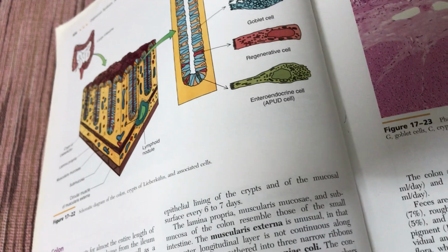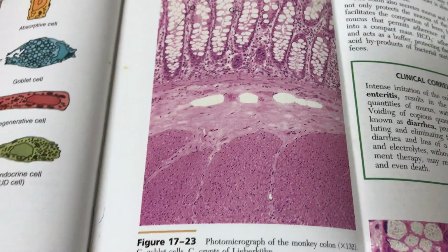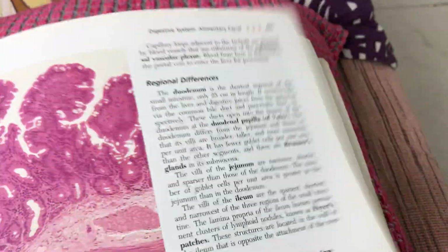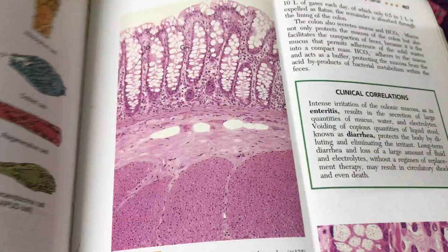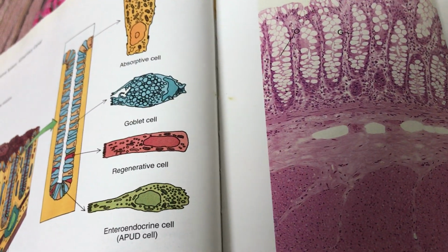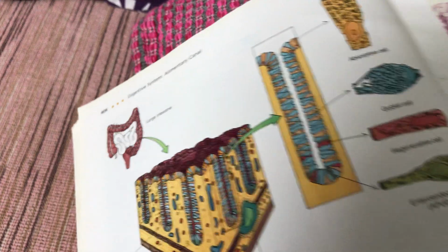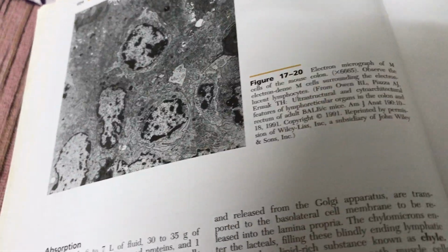Ileum, the important feature of the ileum. Here we will see the colon. Where is the intestine? See, ileum, what is the important feature? Everybody knows the Peyer's patches is the important feature. Peyer's patches are present in the ileum, in the lamina propria, and may extend into the submucosa. So, Peyer's patches very important. It is lymphoid aggregation. You can even see the lymphoid nodule also.